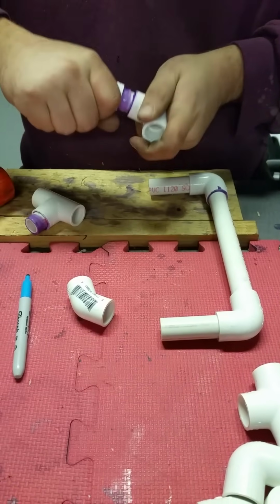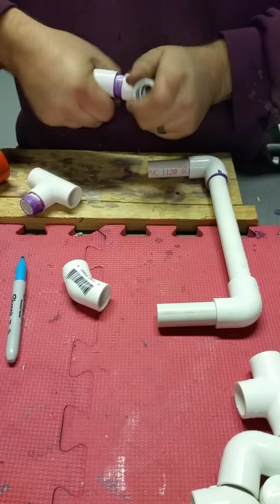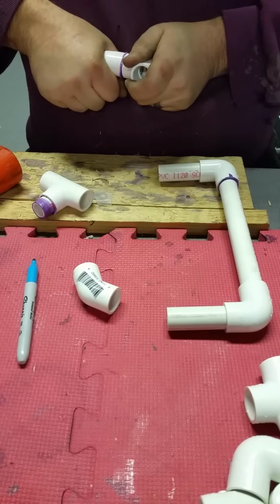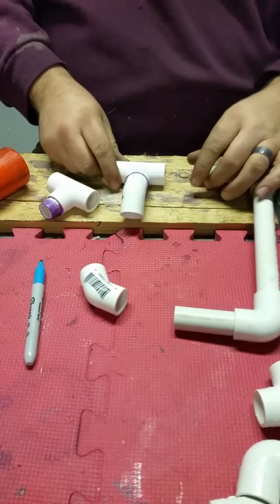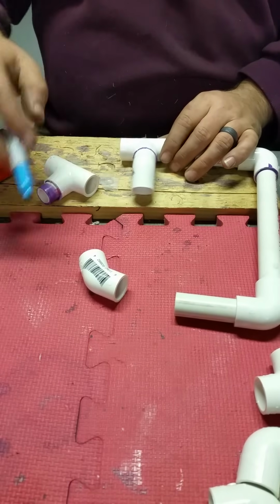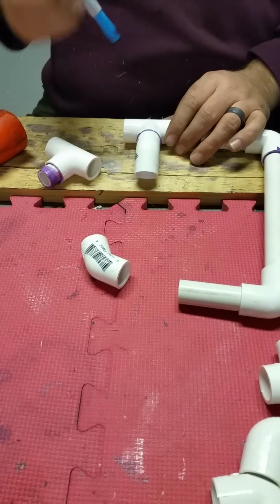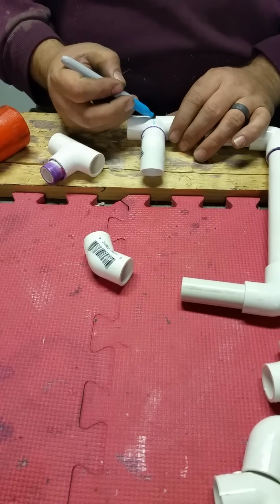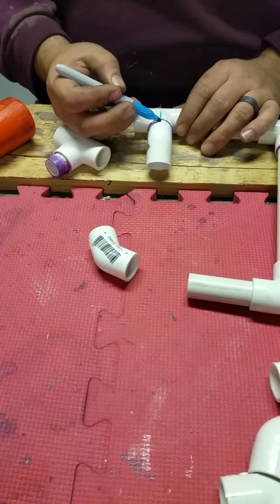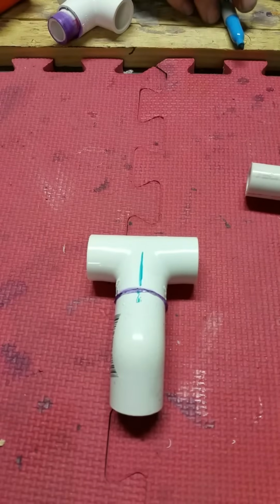So we're connecting the 45-degree angle pieces now to the T, and it should close up nice and tight with the measurement we used. And you want to make sure that they're straight, otherwise your wheels will be crooked. There's usually a line that you can use as a guide on the PVC itself, or there's letters that line up that you can eyeball and follow that it's straight.